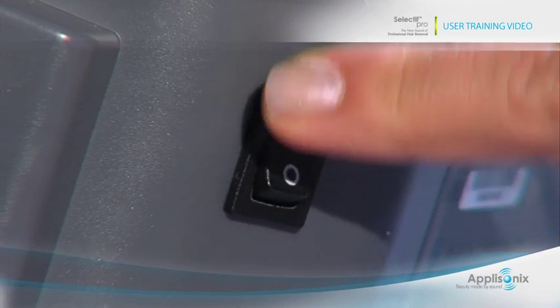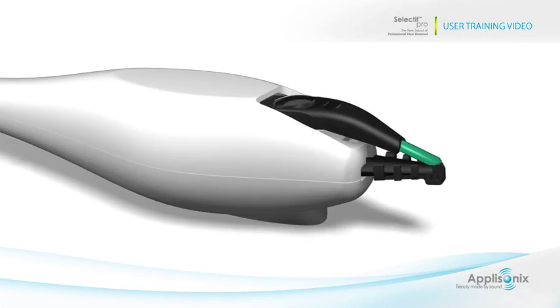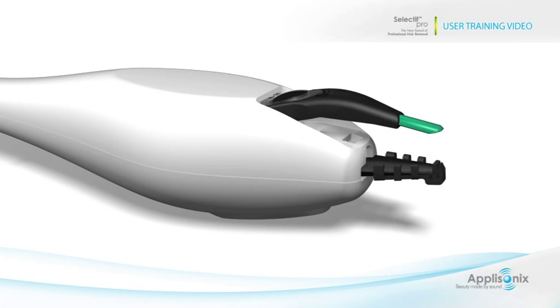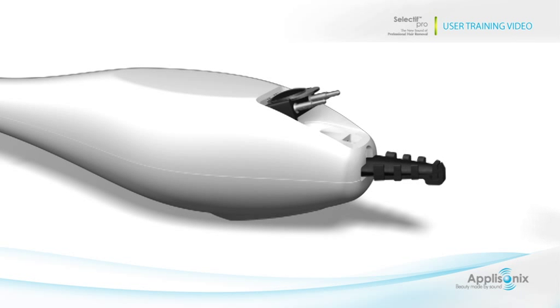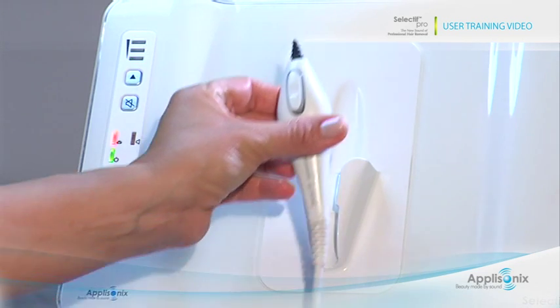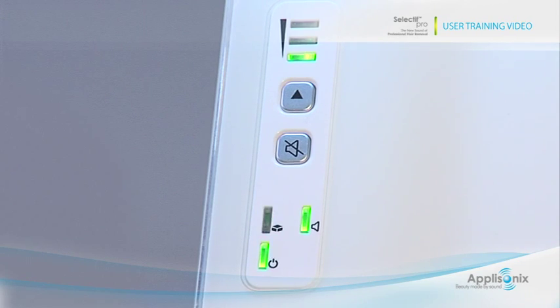Follow these instructions to replace the gripping tip. Turn the power on, remove the probe from its holder and turn it upside down. Using the designated key, pull the safety cap out and remove the tip from the probe. Take a new gripping tip from the package and fit it into the probe until it is firmly secured. Place the probe back in its holder and wait while the system performs self-testing and calibration. The status light will turn green when the system is ready for use.